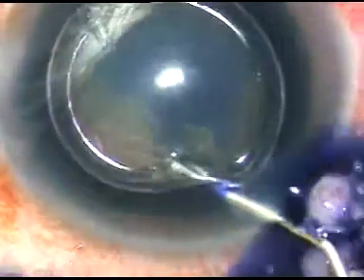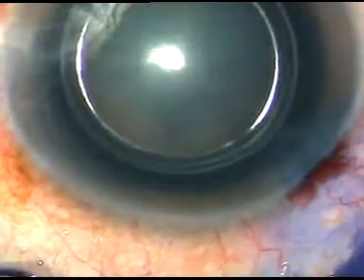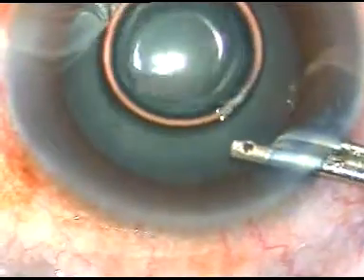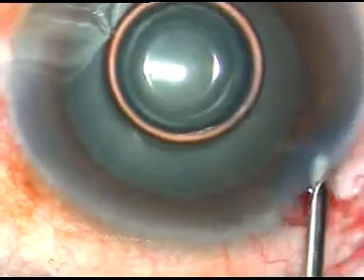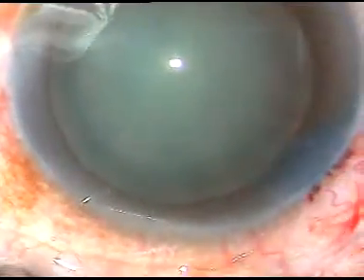Now, trypan blue dye is injected to stain the anterior capsule of the cataract lens. The dye is washed out. Now, viscoelastic substance is injected — this is 2% hydroxypropyl methyl cellulose.